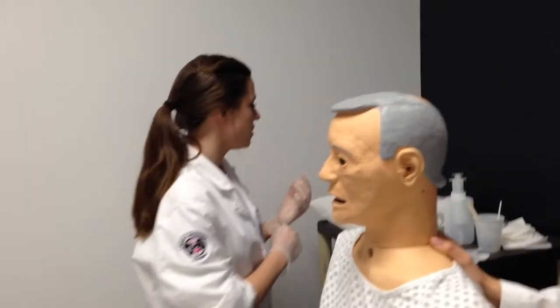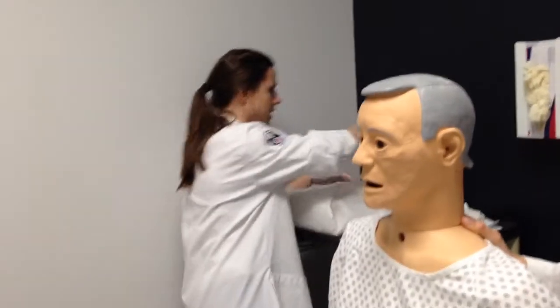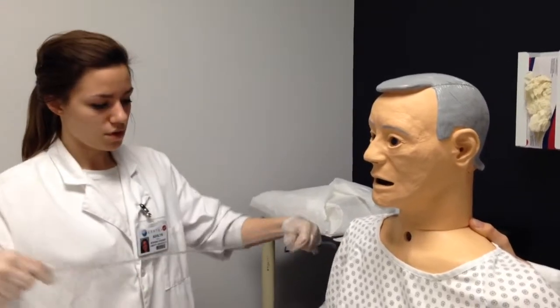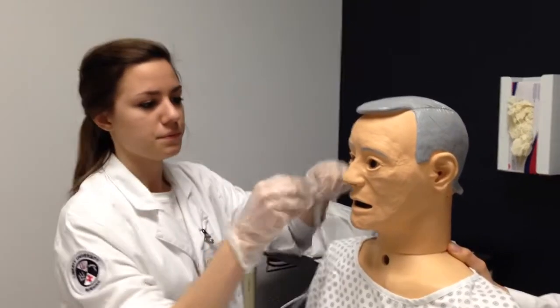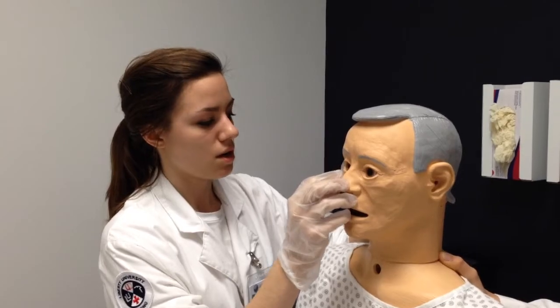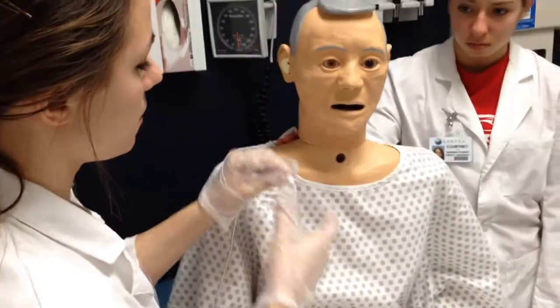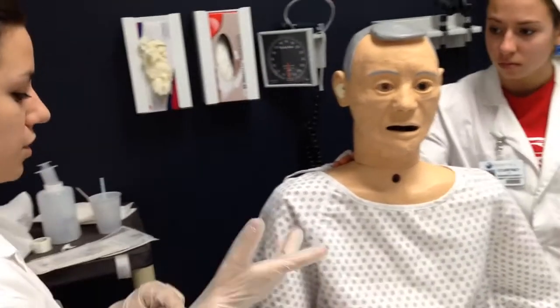Alright, so what I'm going to do is take the tube and measure from the tip of your nose to your ear and then down to your xiphoid process. And we're going to mark it with a piece of tape, and this is going to be our reference point when we're inserting the tube.